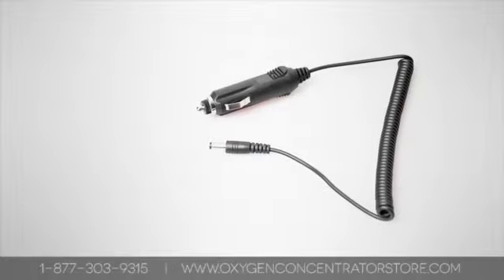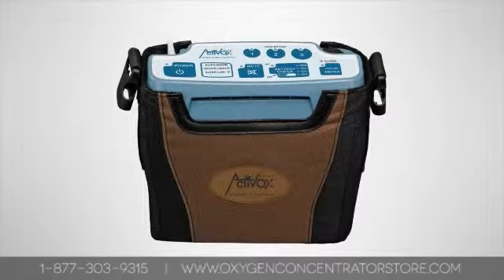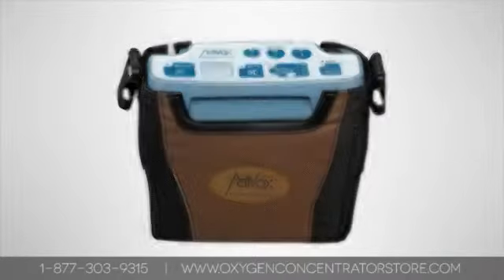All of our portable concentrators come with a DC power supply that plugs into an automobile cigarette lighter. Several of our units charge the battery under this DC power.